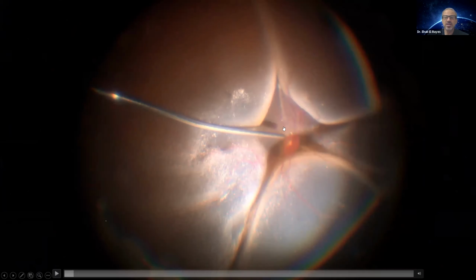So in this patient that had a bullous retinal detachment, a pediatric rhegmatogenous retinal detachment, I can't detach the hyaloid, and you can see that I injected the triamcinolone. How am I going to detach the hyaloid in something like this? And he has a peripheral break. What I'd like to do mechanically is vacuum or aspiration, or sometimes using a Thanos scraper or a diamond dust scraper. It doesn't help in something like this.